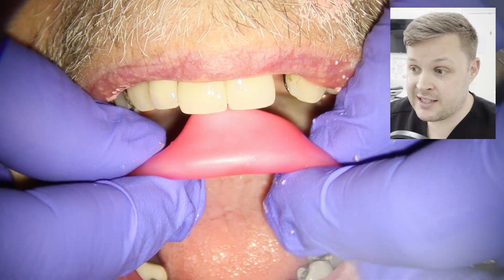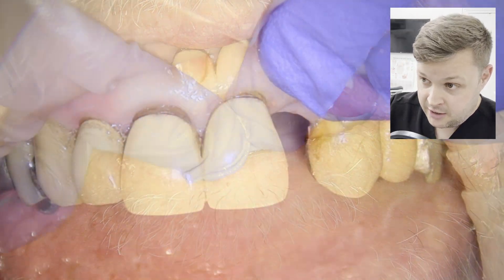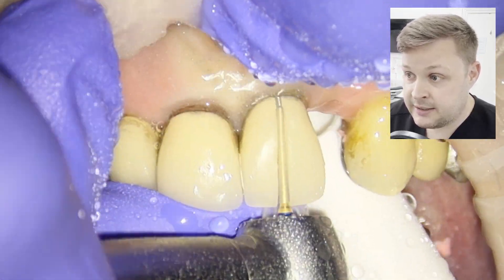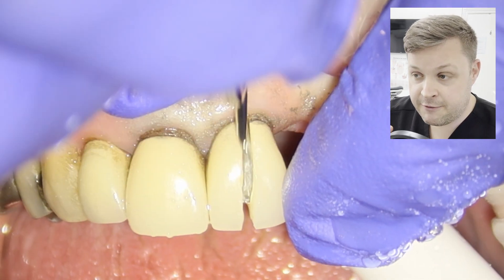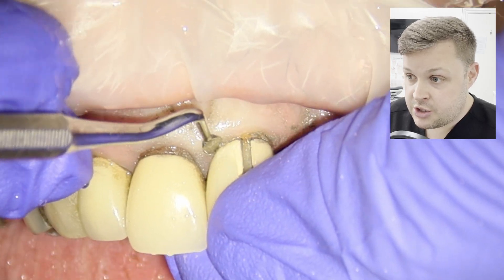The first portion of this treatment procedure is doing all the ancillaries: taking an index so we can make a temporary crown, taking the bite, and taking an opposing alginate impression to send to the laboratory. Luckily with this case, the patient lost his upper left two, but the upper left one had a full coverage crown, so it's not going to be too destructive to make a full coverage cantilever bridge.